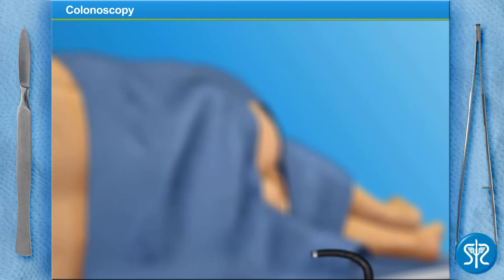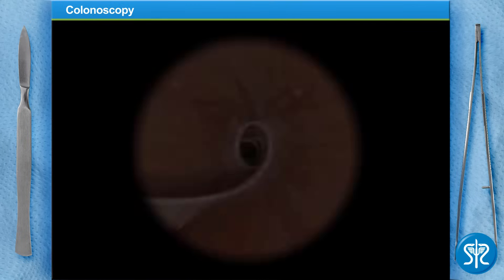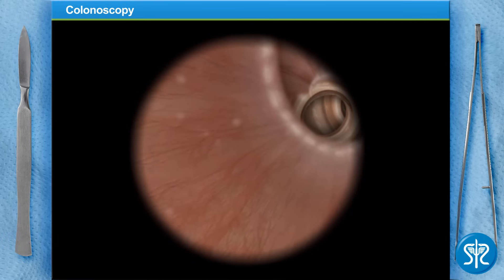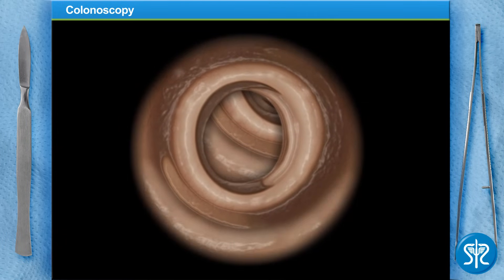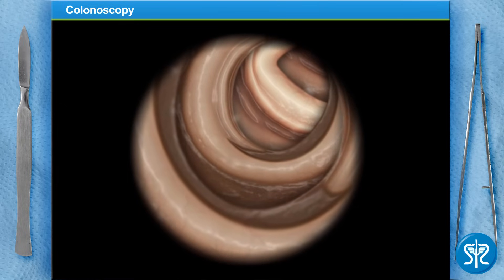Carefully insert the scope into the patient's anus and slowly move it into the colon — we can watch the camera's output on the monitor. We're into the rectum now, nothing so far. Let's move on into the sigmoid colon — slow and steady. Descending colon is next. Now is a good time to remind our patient to breathe slowly through her mouth as we do the exam.